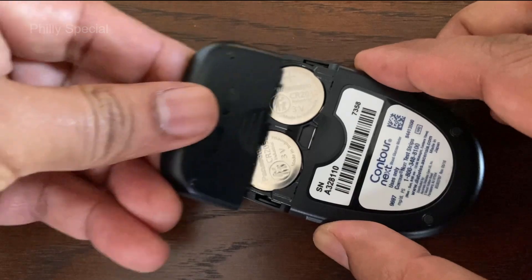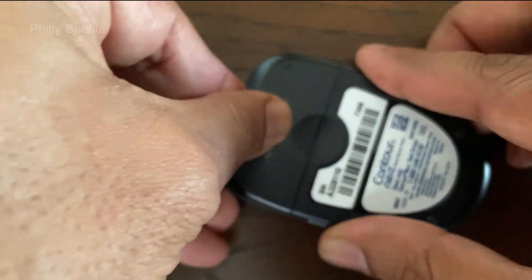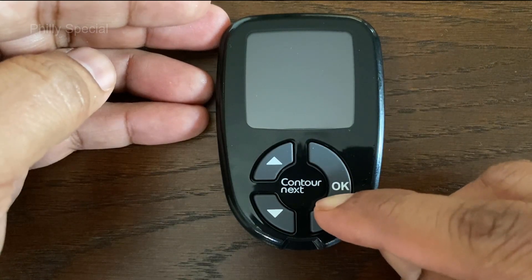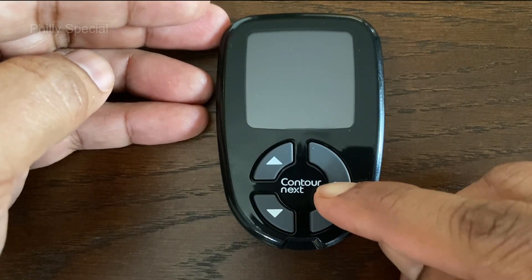To close, angle the battery cover back onto the meter and snap into place. If you put the new batteries in the meter within 5 minutes of taking the old batteries out, the meter saves all your settings and results.